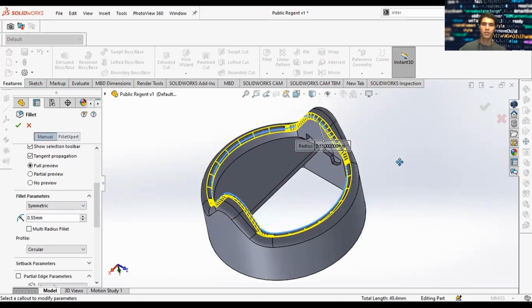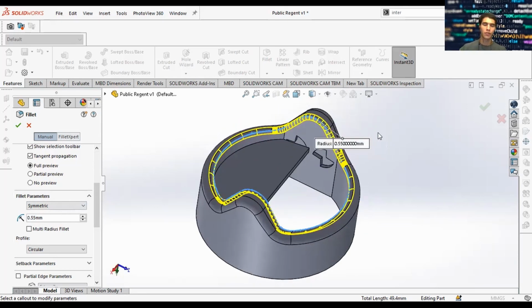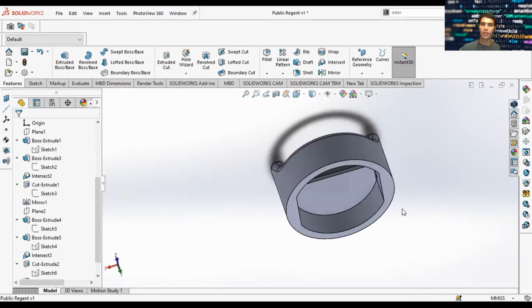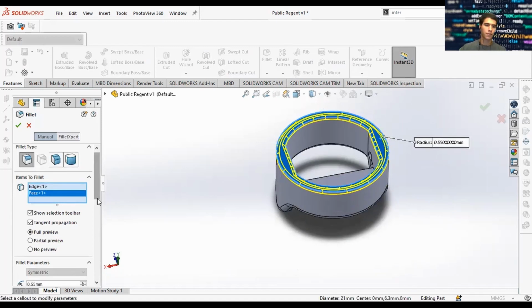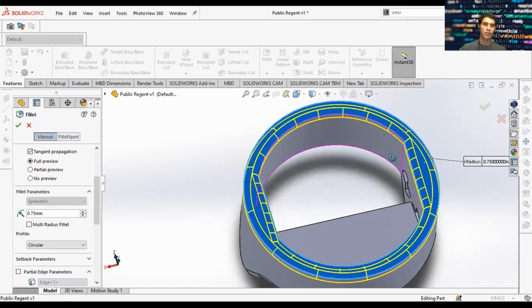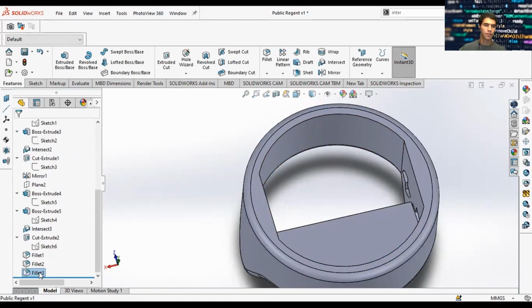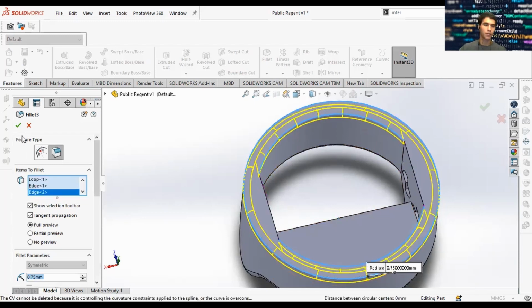So these are fillets that are constant radius. You can also do multi-radius fillets, which are a little bit more complicated, but it's still nice, and especially in biomedical applications where you need to have gradients of fillets for particular edges. But this is our fillet, not too shabby. And let's finish the fillet down here. So same principle applies. We'll go from bigger fillets to smaller. So it seems like the biggest thing we can do for a fillet is this 0.75 millimeters. We filleted this loop. Let's also fillet this loop here, these edges.